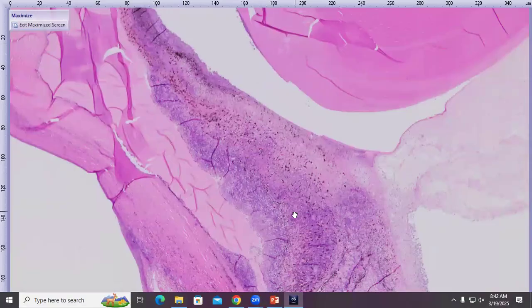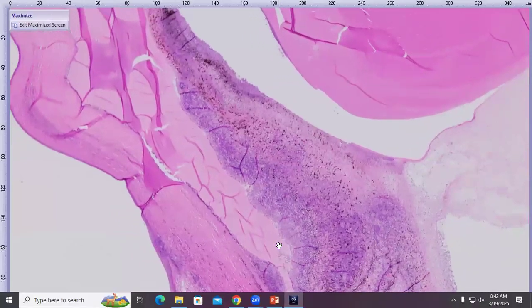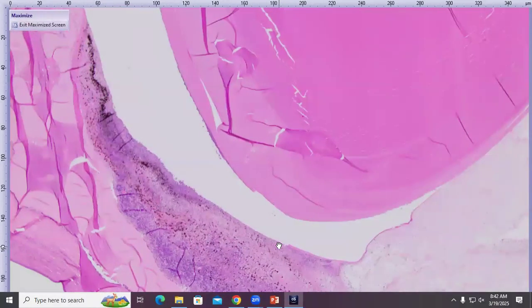So this lymphoplasmacytic inflammation in the uveal tract, coupled with the carpeting of the epithelioid macrophages, and with this cataract formation and this leakage of the lens protein, is consistent with what we call asynchronous uveitis. It's also asymmetric uveitis might be what people are familiar with at the moment, but we're trying to get it changed to asynchronous uveitis because these dogs usually present with one eye affected first.